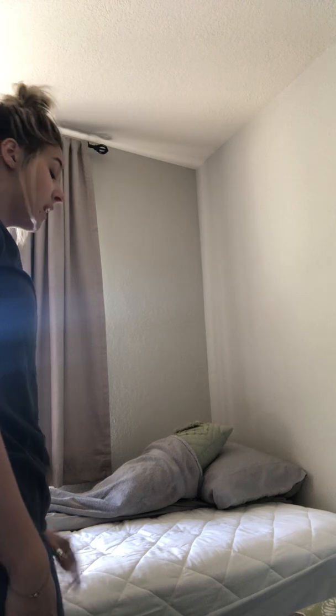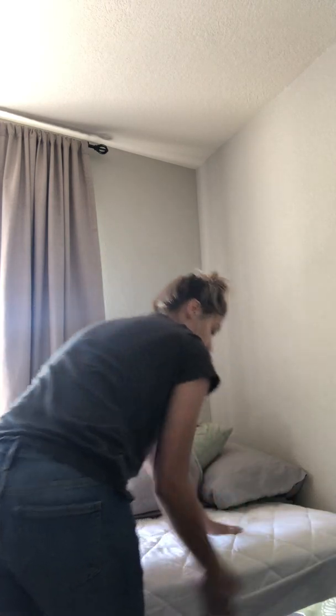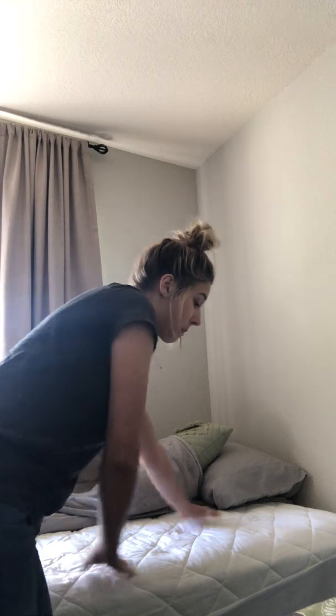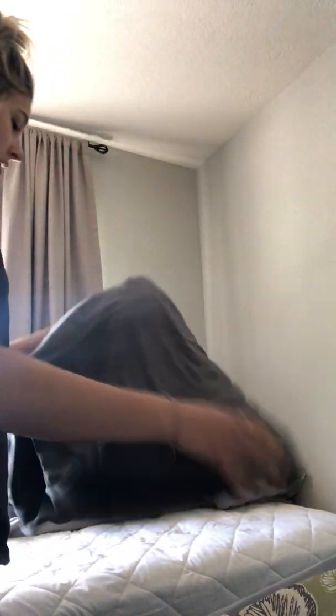Then I'd use proper hand hygiene and take a disinfectant wipe and wipe the bed, making sure I disinfected the whole pad — wiping it all, making sure it was dry. Then I'd take my new linens. Here's my new fitted sheet, and I'd start to put that on, unfolding it.